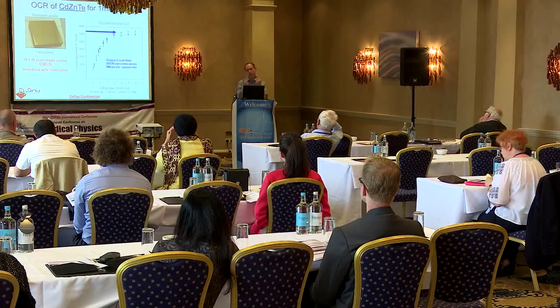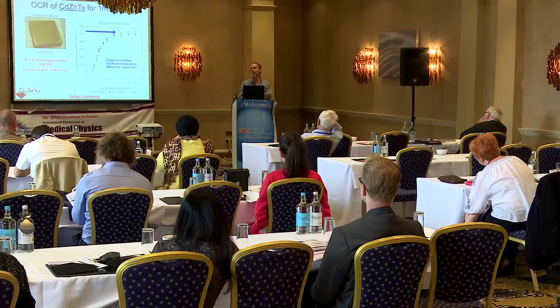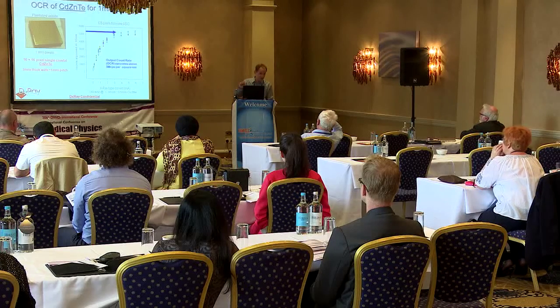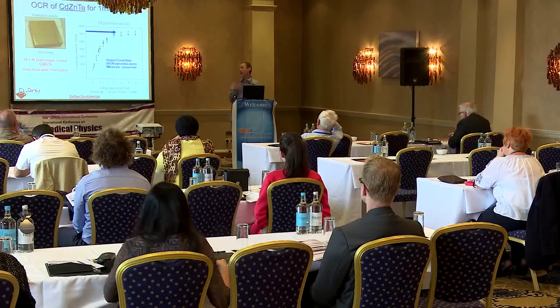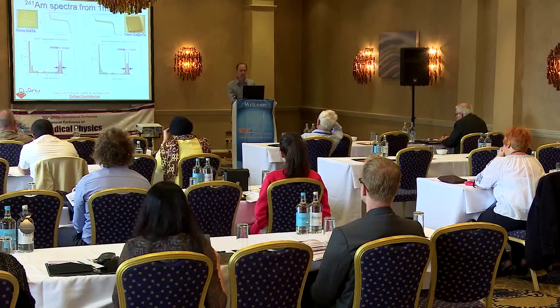But when you're doing very, very fast photon counting, you use a peaking time of only a few nanoseconds. And in that case, the dark current doesn't contribute to the noise, but rather only the stray capacitance contributes to the electronic noise in the system. And so in these types of systems, you can use both cadmium zinc telluride and cadmium telluride, provided that you minimize the stray capacitance on the input of the preamplifiers.